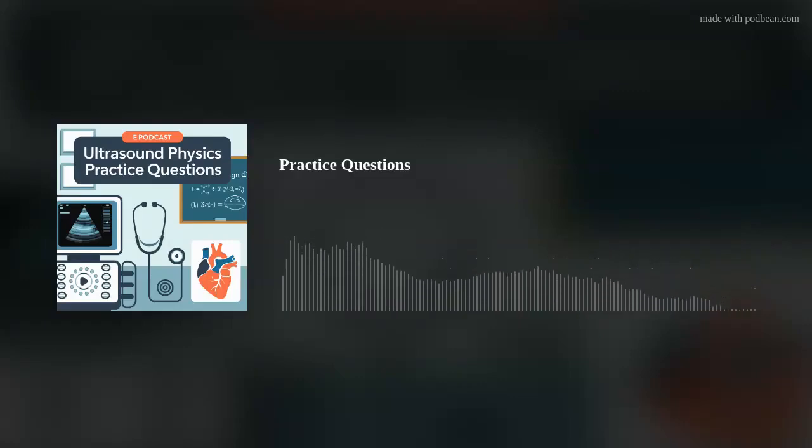Okay, back to color Doppler. This one says blue always means venous flow. True or false? Definitely false. Remember, those colors in color Doppler don't tell you if it's a vein or an artery directly. They just show you which way the flow is going compared to the transducer. Blue usually means flow away from the transducer. Red means towards it. Right. It's not about the type of vessel. It's about the direction of flow relative to that ultrasound beam.